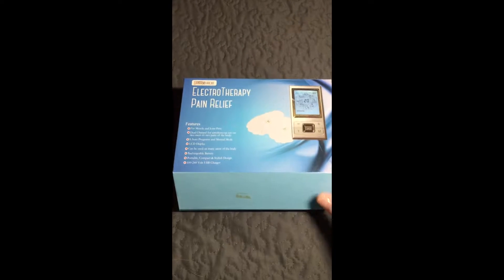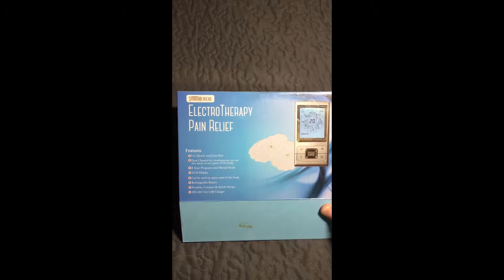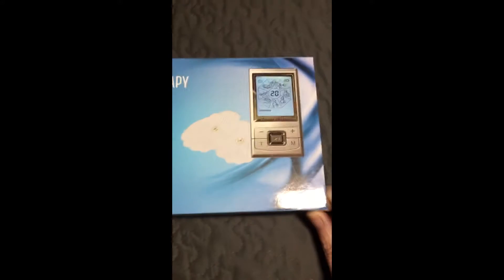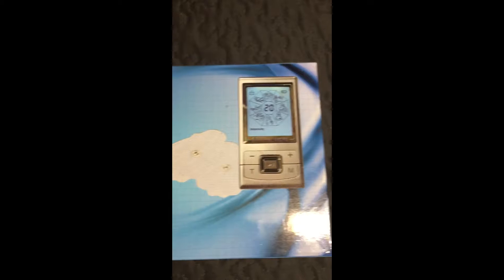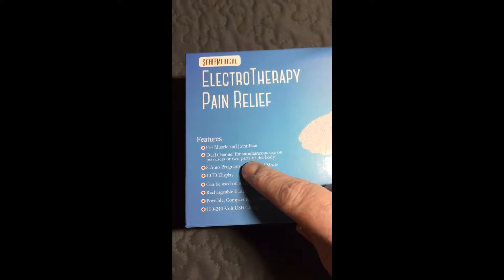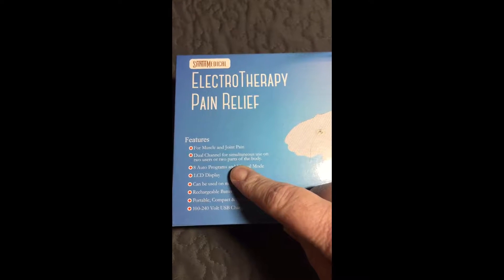Hey there, it's Majenica again. So we have a Santa Medical Electrotherapy Pain Relief — in short, it's a TENS unit, a nice spiffy massager thing. For muscle and joint pain, it has a dual channel for simultaneous use on two users or two parts of the body.